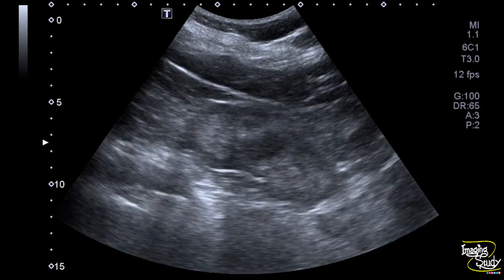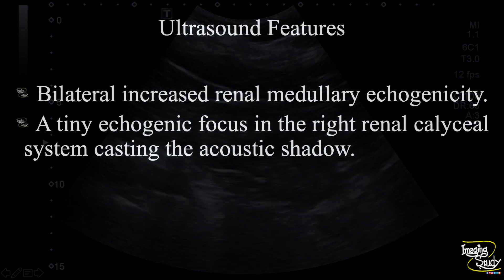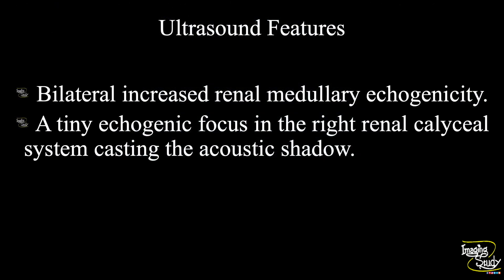Here is the left kidney and you can also see the increased echogenicity of the medulla. The posterior aspect shows faint acoustic shadows. In summary, bilateral renal medullary echogenicity is increased indicating medullary nephrocalcinosis. A tiny echogenic focus is noted in the right renal caliceal system casting faint acoustic shadow, indicating a tiny calculus.